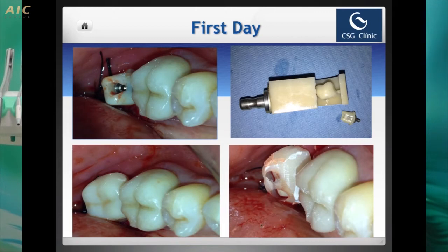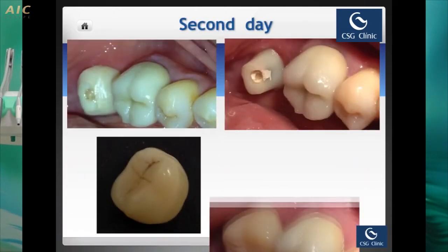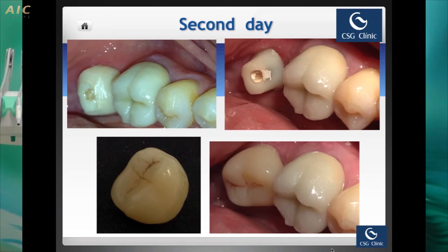After three months, on the second day, the patient comes, and you can see it here in the pics, with all the gums very well healed. Then I take out the provisional crown, and I place the crown with the same design that I previously had milled in the permanent material, okay? So I cement the permanent crown, and I only need two appointments from the day I place my implant to the day I finish putting in my crown. So it's very good nowadays: the five stages that we used to have are now two, okay?